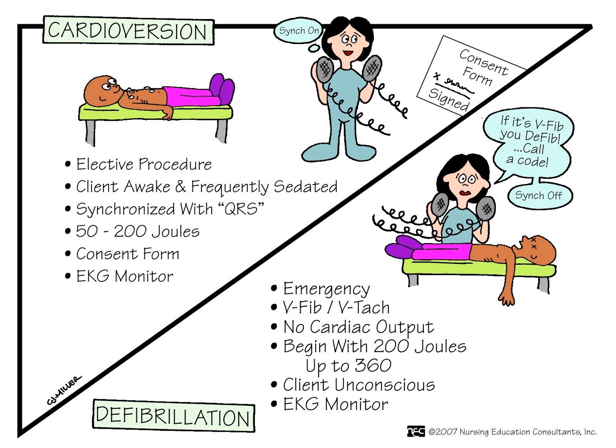As we said, we put it on the sync mode, so it's synchronized with the R wave or the QRS complex. The patient signs a consent form before the procedure. It's in the chart. Okay, we have plenty of time. It's an elective procedure. Elective, not in the terms the patient gets a choice, but elective in terms that we can schedule it with the physician when it fits in. Usually it's the next day, may even be later that day, but it can be scheduled. The patient should be connected to an EKG monitor during this procedure.